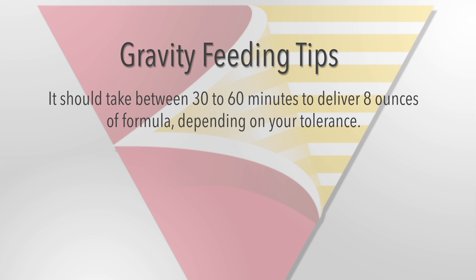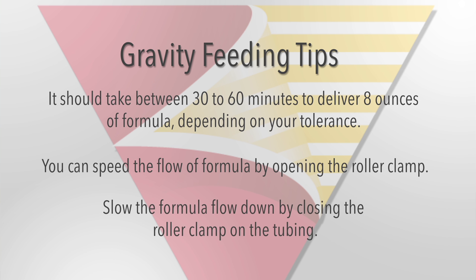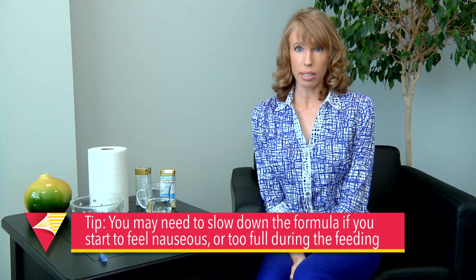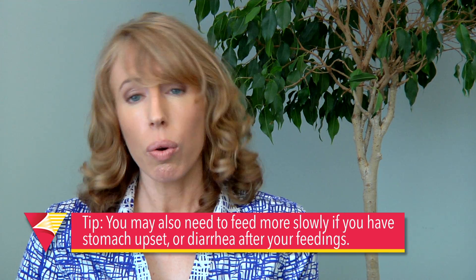It should take between 30 to 60 minutes to deliver about 8 ounces of formula using the gravity feeding method. This depends on your tolerance. You can speed up the feeding by opening the roller clamp, or you can slow it down by closing the roller clamp on the tubing. You may need to slow down your formula if you experience nausea or fullness during your feeding. You may also need to slow down your formula if you have diarrhea or an upset stomach immediately after your feeding.